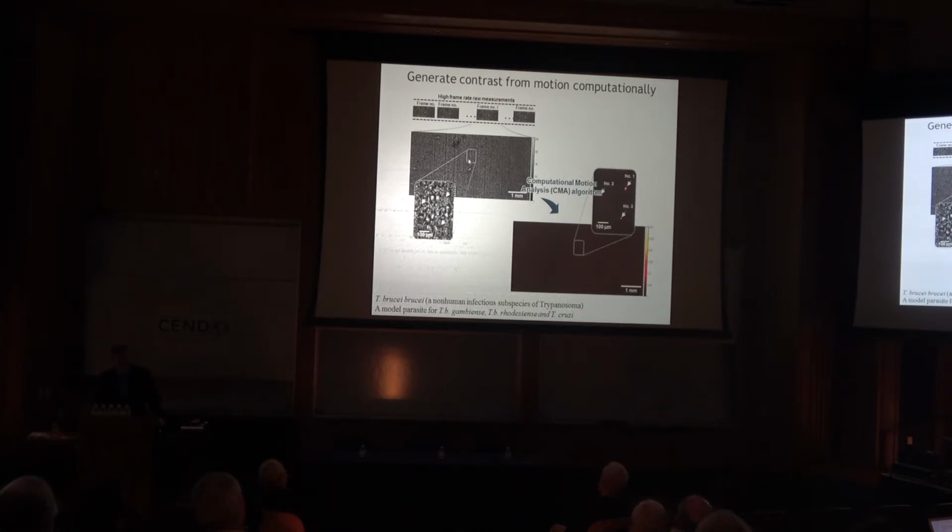Raw images look like speckle patterns. You cannot really spot anything here. But again, it's the differential analysis over those 50, 60 frames within that 2-second window that we analyze at the end to give you a contrast that correlates with motility. And that motility is the trypanosome signature within that 1 milliliter rectangular tube.